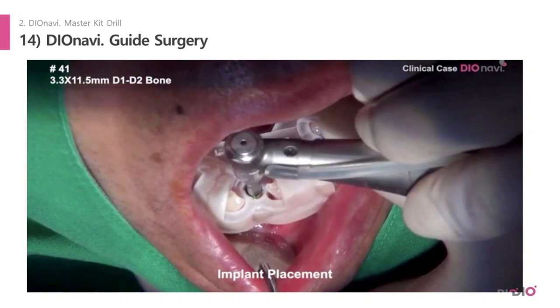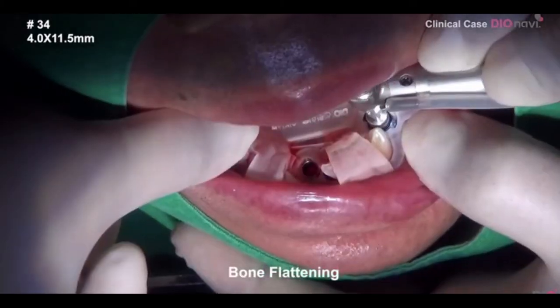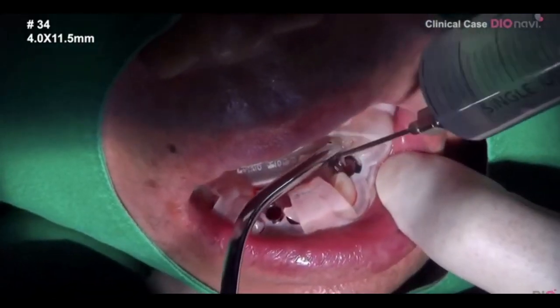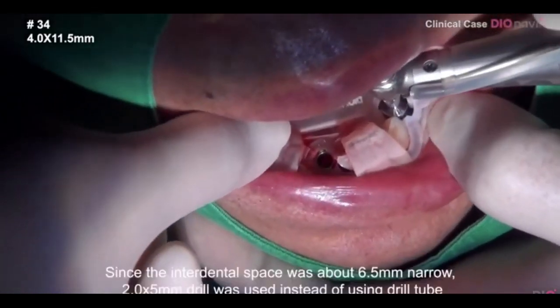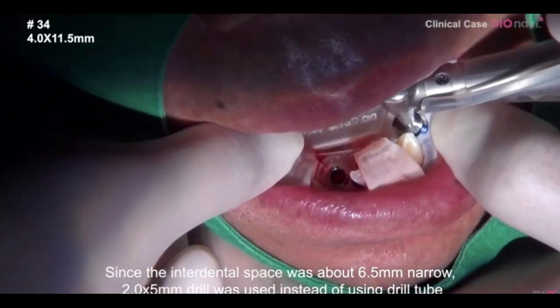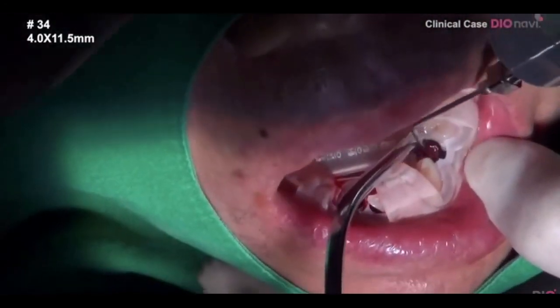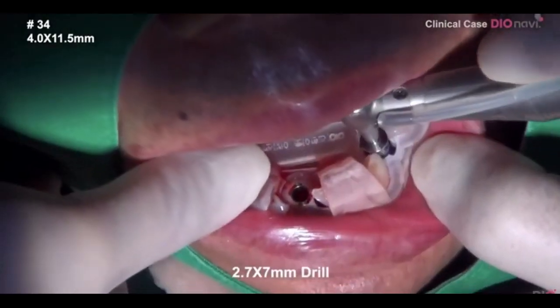Let's take a look at this video for the last time. This is a DIOnavi surgery video. You can see that the surgeon is using the bone flattening drill now. And now the needle tip goes in for irrigation. The 2x5 drill goes in and out, and the needle tip goes in again for irrigation. You can just think that irrigation is done after every drill. When irrigating, use a suction so that it is comfortable for the patient.